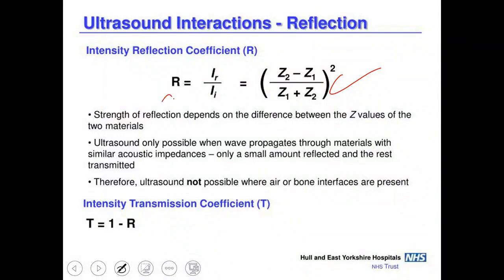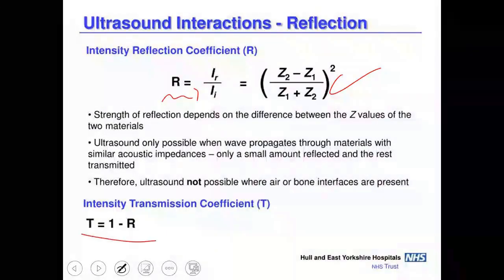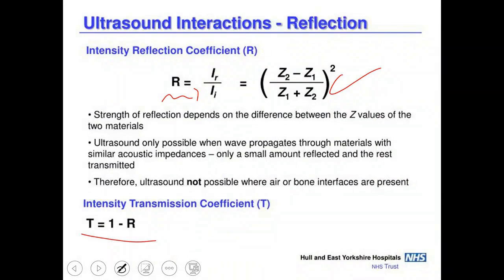For instance, hypothetically, if we assume that your calculated reflection ratio stands at 50%, then logically the transmittance would equally stand around 50% too, thus representing the other half remaining.